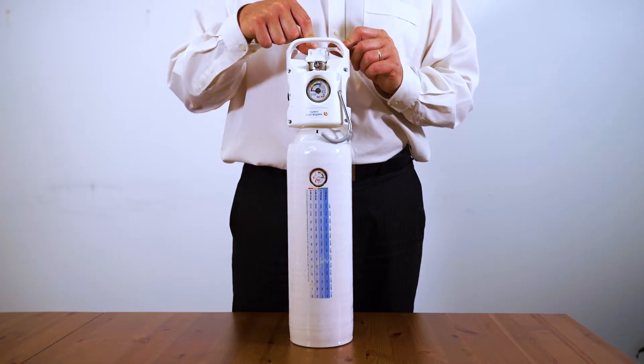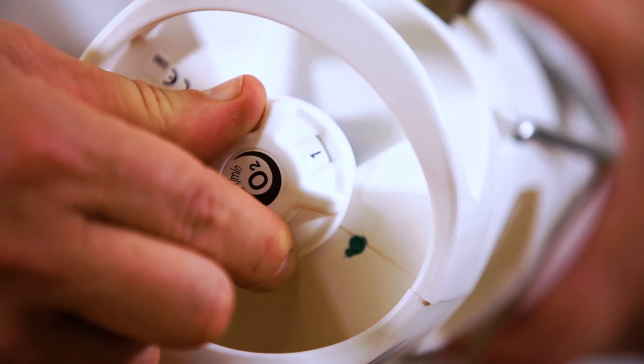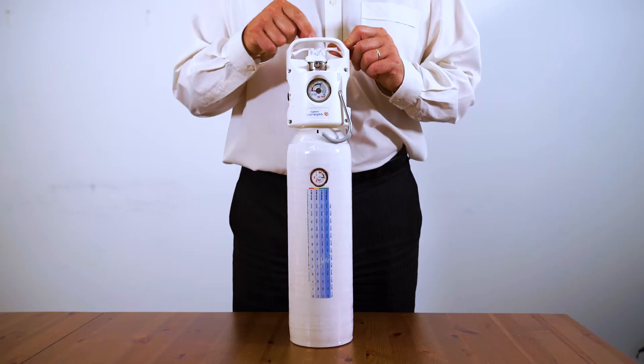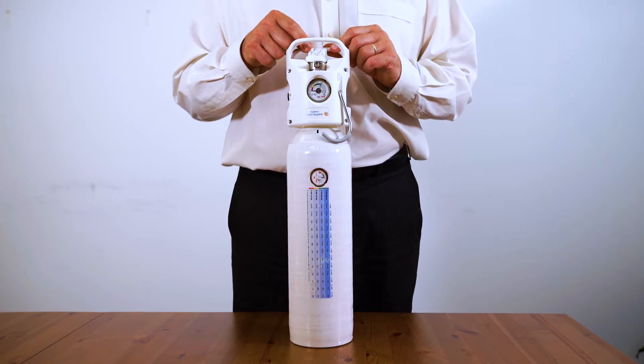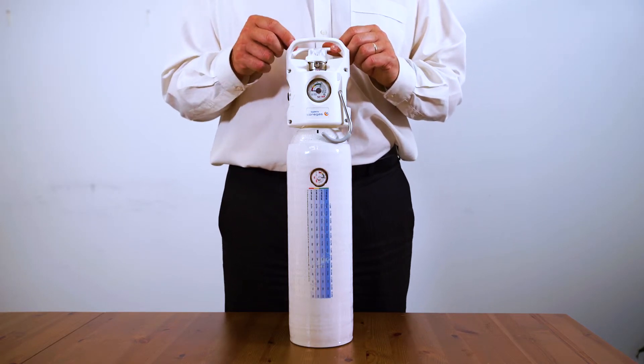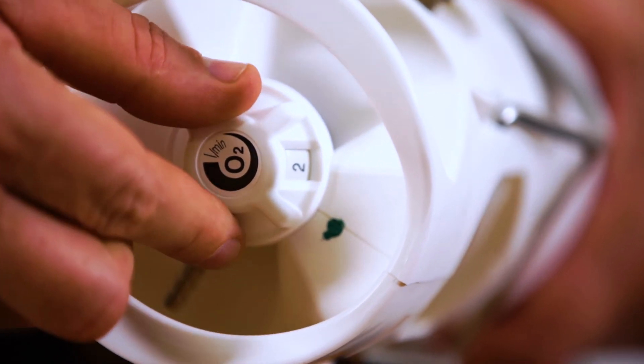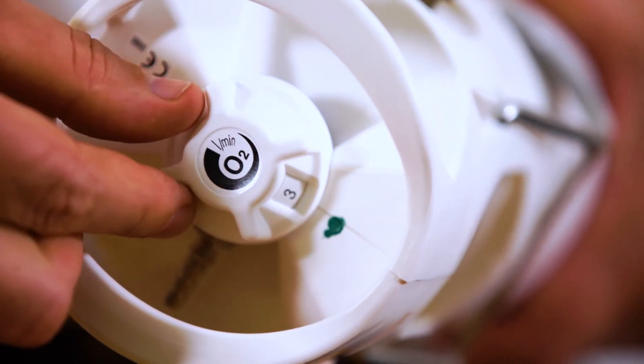The next step is to select the litres per minute you require by turning the flow knob on the top of the cylinder. As you rotate the knob, you'll see numbers appear which are litres per minute. Simply select the litres per minute you require and administer the oxygen to your patient. Note there is flow between settings, but you should always select one full setting.